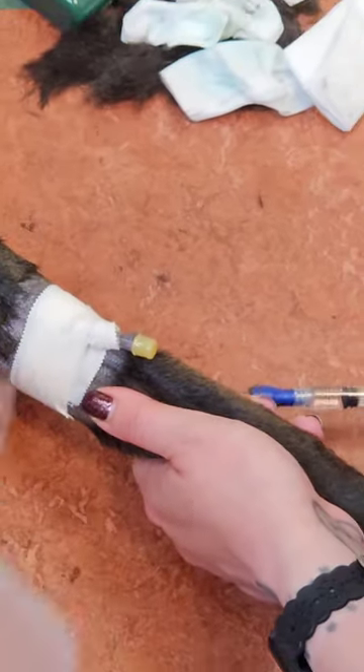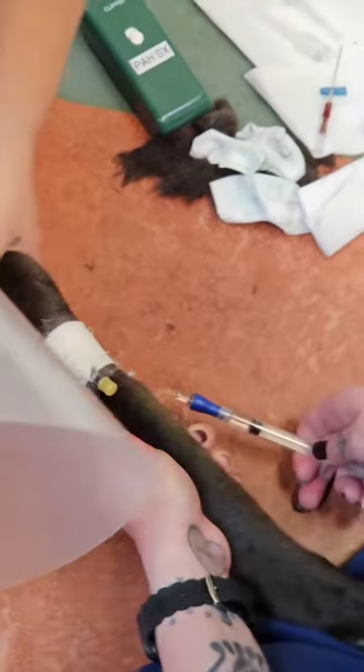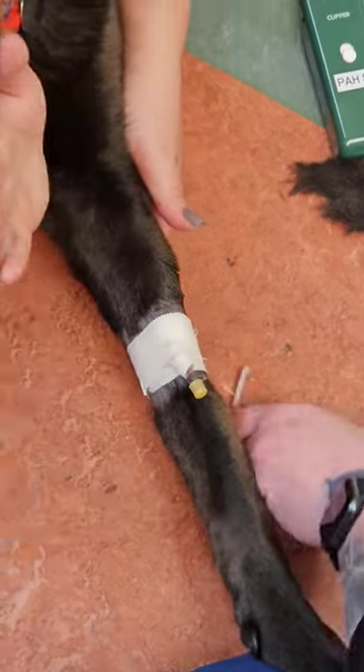She was just checking the catheter there, flushing. The assistant is holding off and she's drawing back — you can see that she got blood back, then she flushed in a little bit and the catheter is patent.